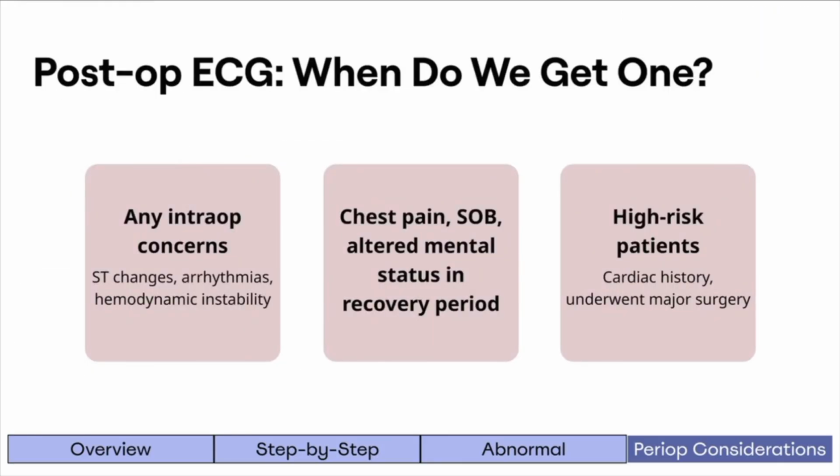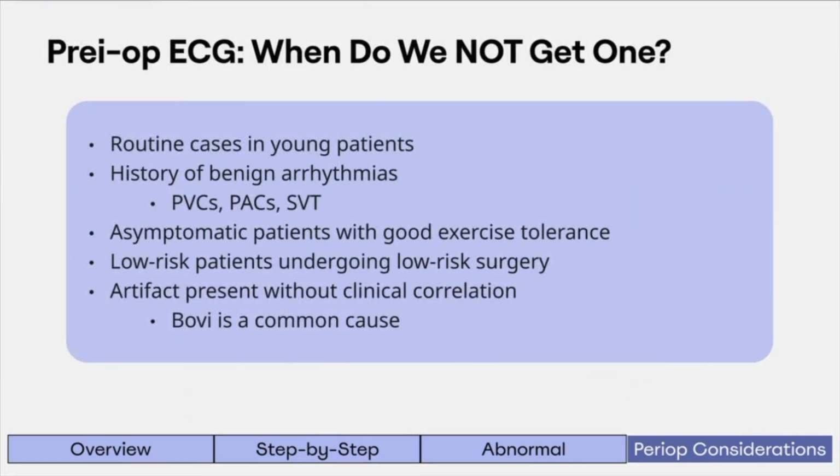A postoperative ECG should be obtained if there were any intraoperative concerns such as ST changes, arrhythmias, or hemodynamic instability. It is also indicated if the patient develops symptoms like chest pain, shortness of breath, or altered mental status in the recovery period, or in high-risk patients, especially those with cardiac history or undergoing major surgery. Many perioperative cardiac events, including ischemia, infarction, and arrhythmias, occur minutes to hours after surgery, making early postoperative ECG monitoring critical. ECG monitoring should be targeted and guided by clinical context rather than routine.